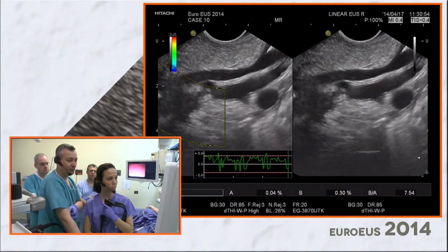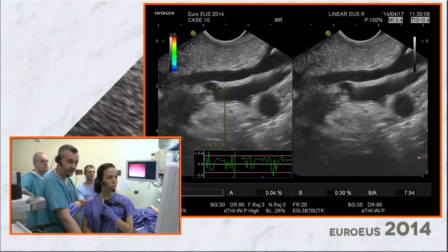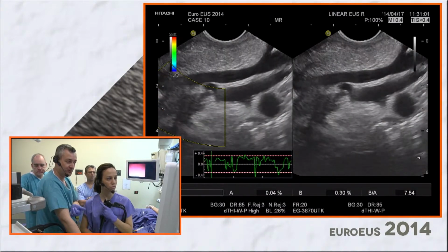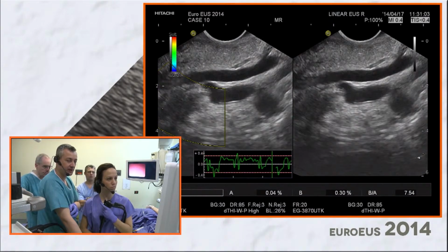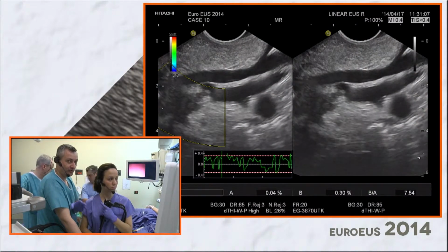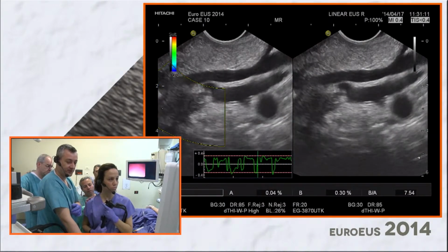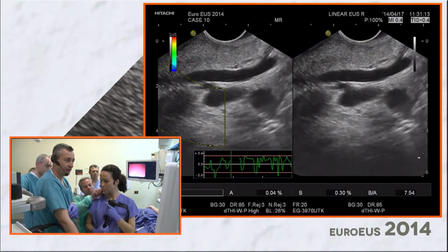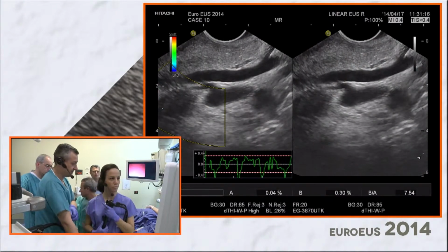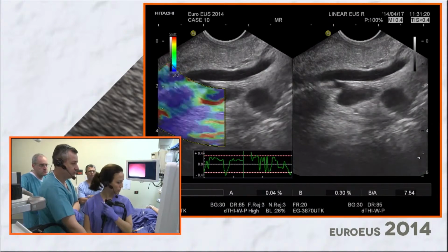And we have discussed already, because the patient has two negative fine needle aspiration procedures, one endoscopic, the other one transabdominal, as far as I understood. We will probably do a third one, but we thought that contrast would be really important for this patient because we can get some more information after elastography and contrast. So if Mara agrees, we can switch to perform contrast.